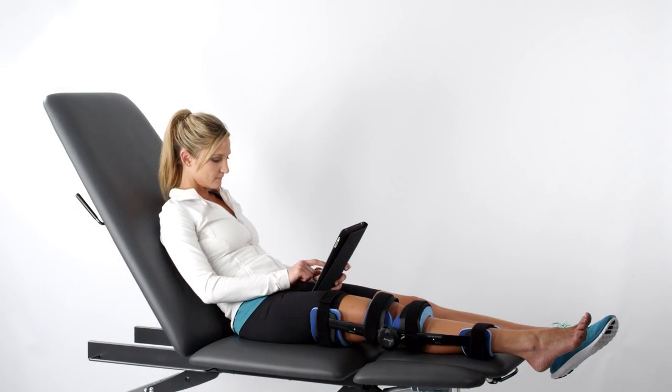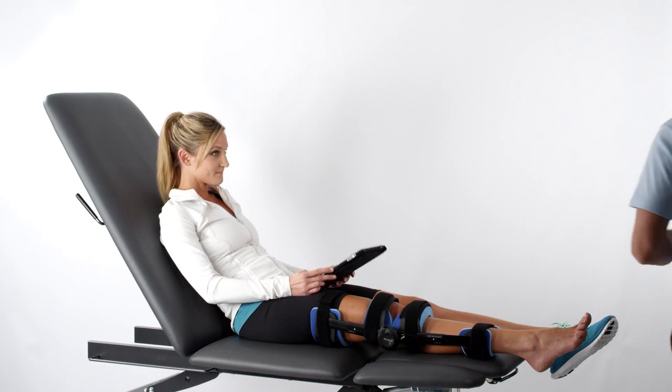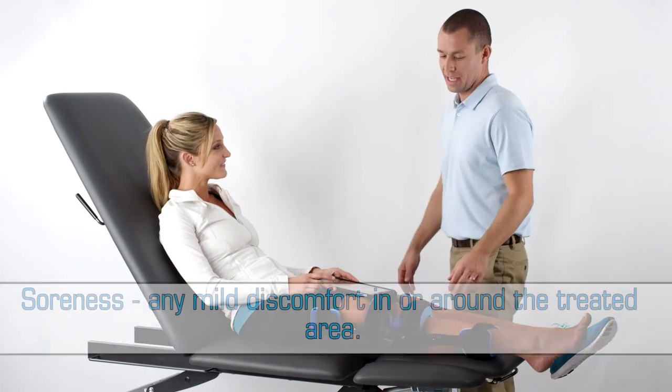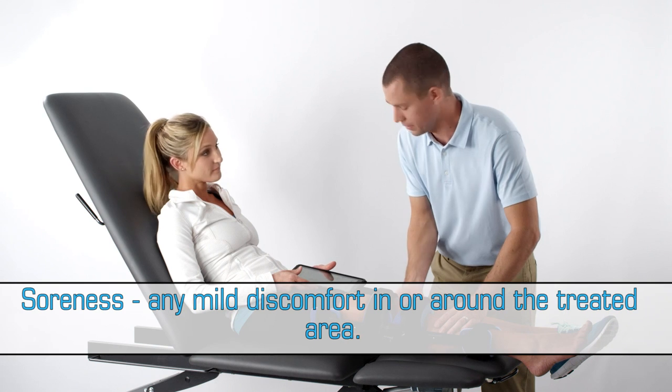Ideally, the patient should progress to the maximum wear time set by a physician or skilled therapist while at rest or sleep and in compliance with the following post-wear criteria. The patient should not experience any additional soreness or stiffness from wearing the orthosis for more than 1 hour following the removal of the device. Soreness is defined as any mild discomfort in or around the treated area.